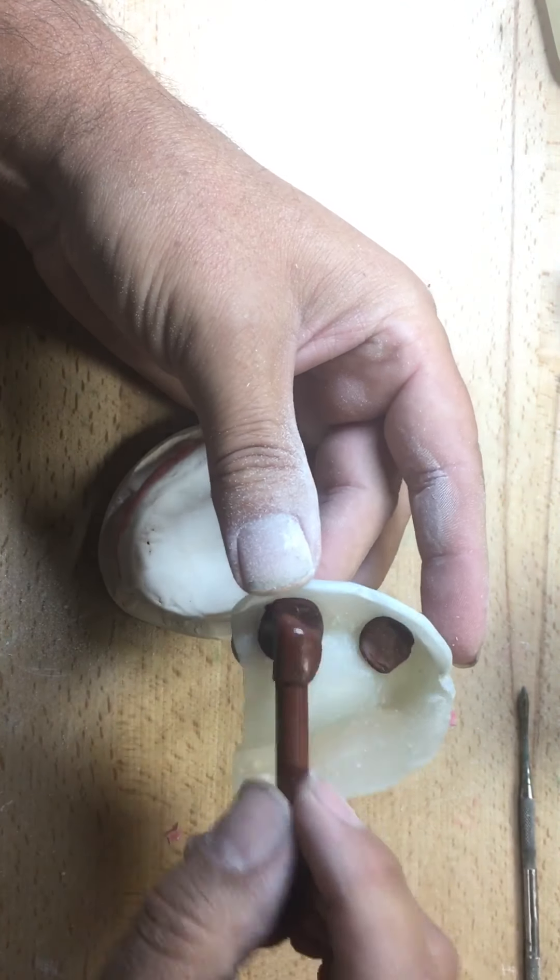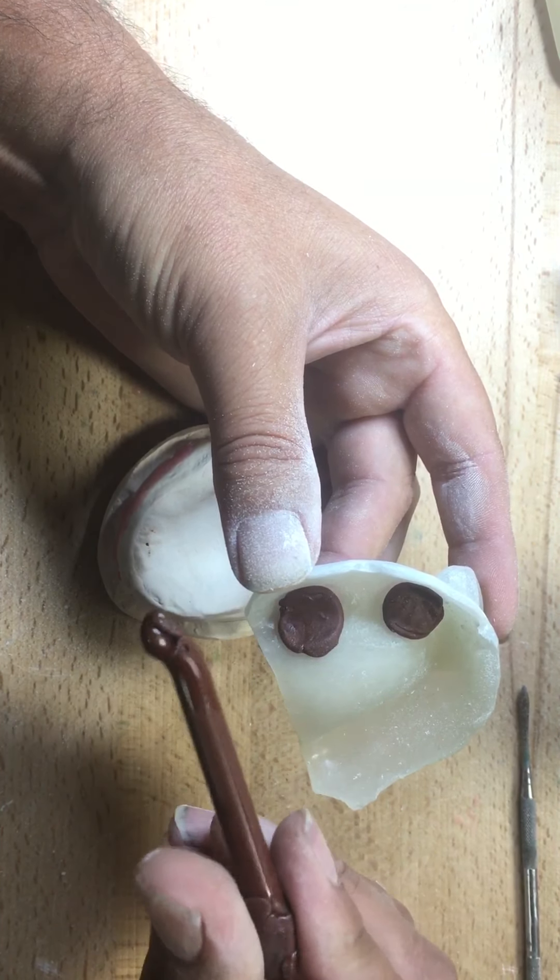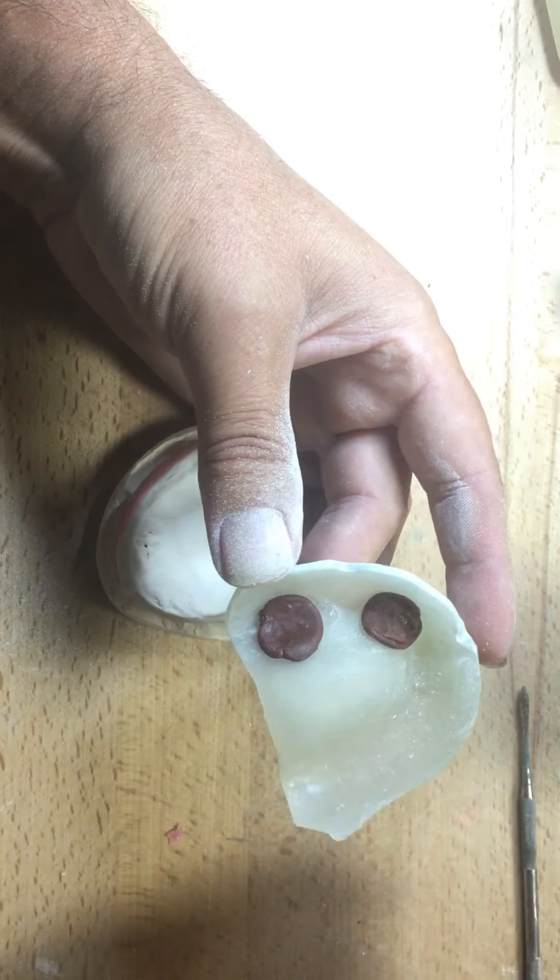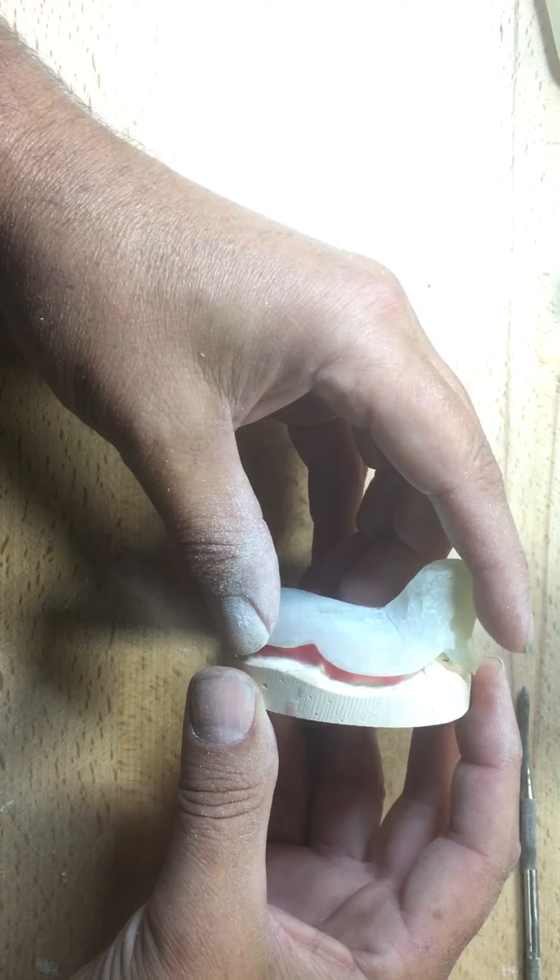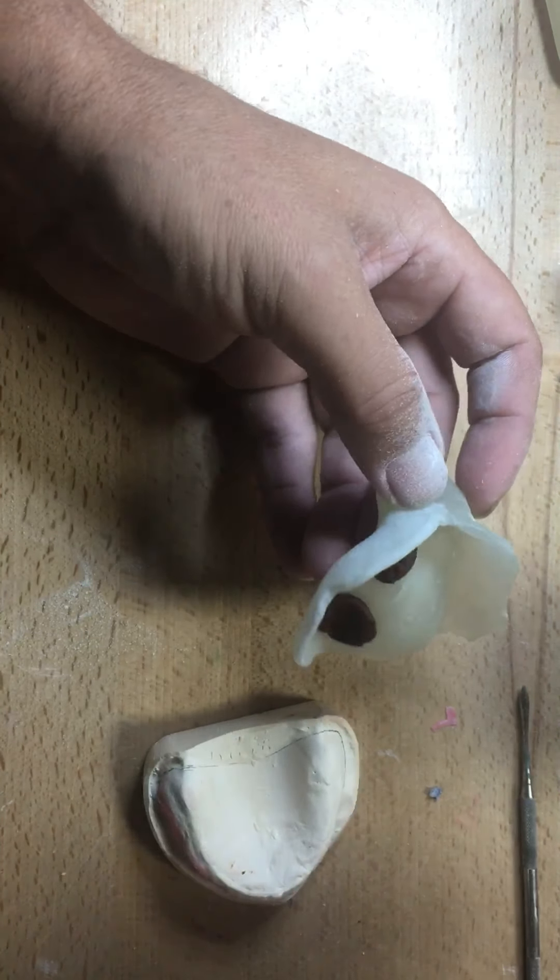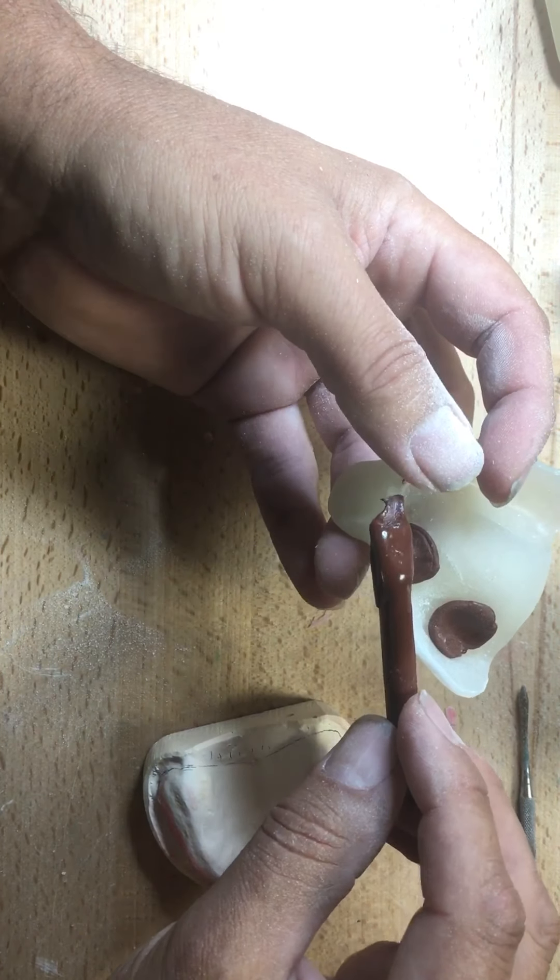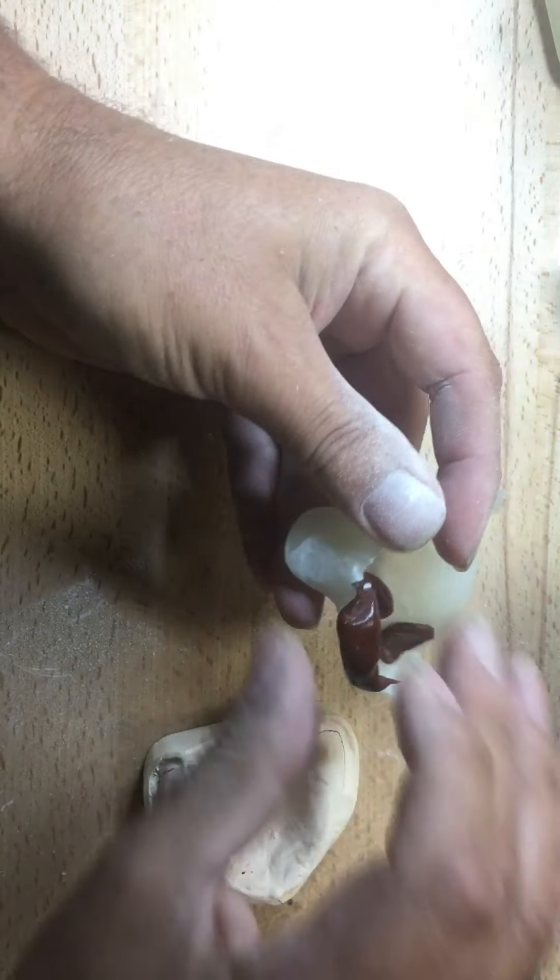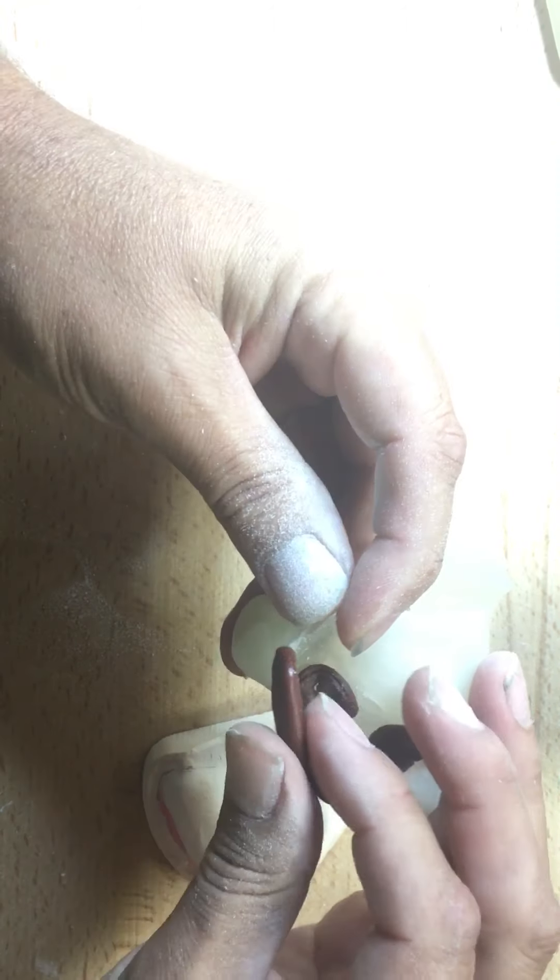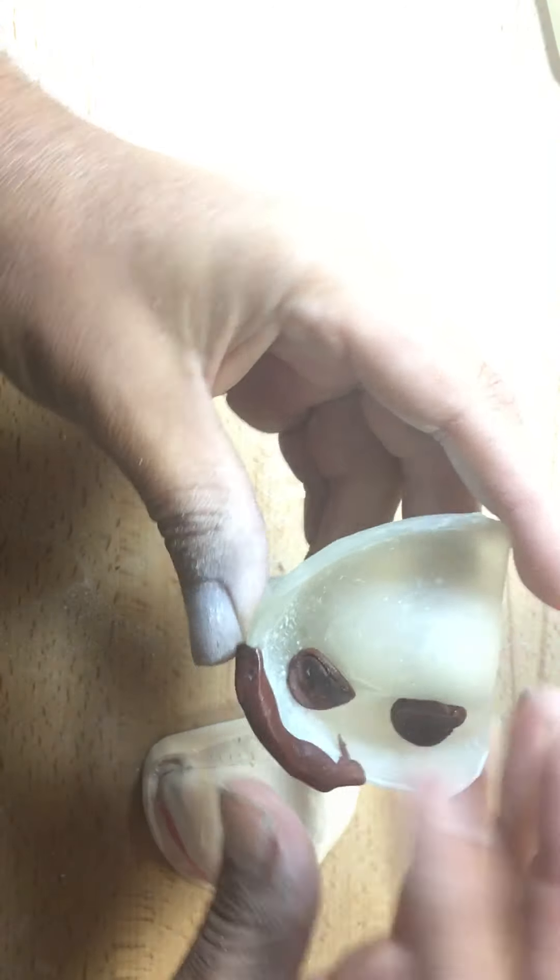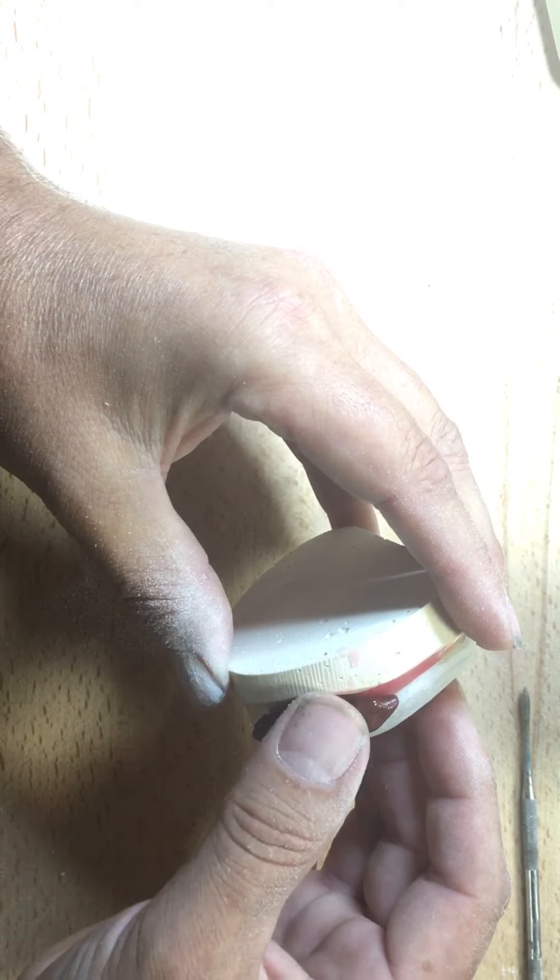It's not going to probably come off because it's going to stick to the model because I didn't wet the model. So I'll just do that again. This time, I'll wet the model. Great simulation, eh? Maybe it's just a little softer. This is, again, simulation. So I'd have my four stops. You can see this is an impression material. This is a final impression material, although very rigid, the compound. This compound used to come in sheets. I guess it's a latent gene from the 1960s, but still works really well and is accurate. So there's two. I'm going to put two more on this side. As you can see, it's kind of elevated the tray pretty much to where my line was, where, again, my next step now of border molding.